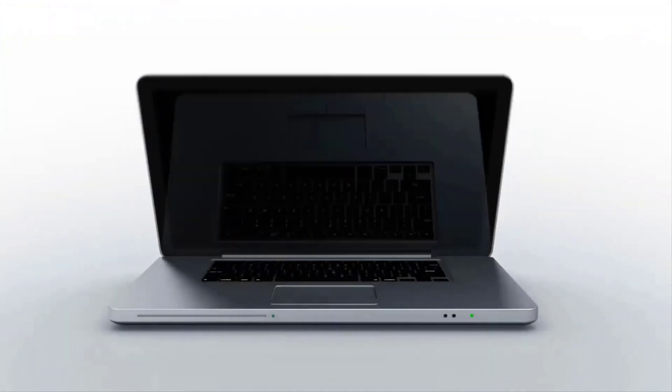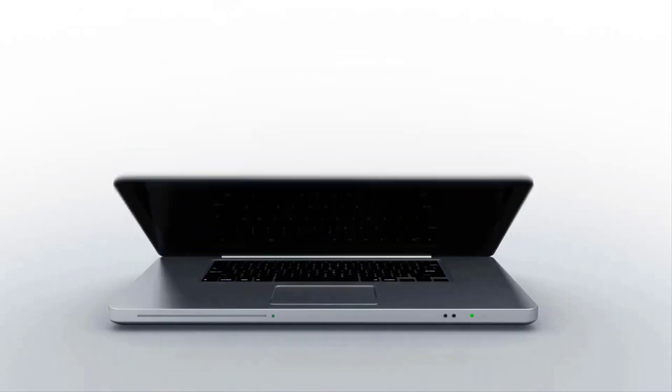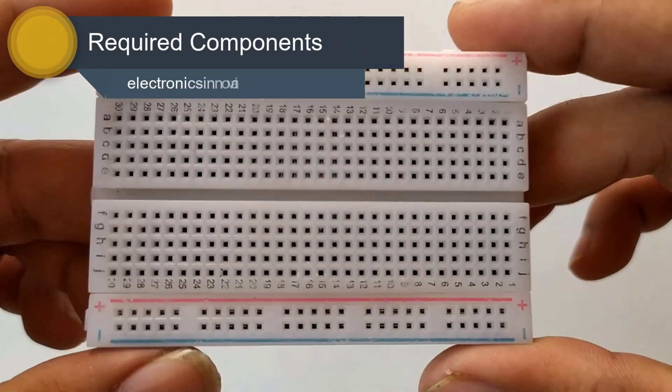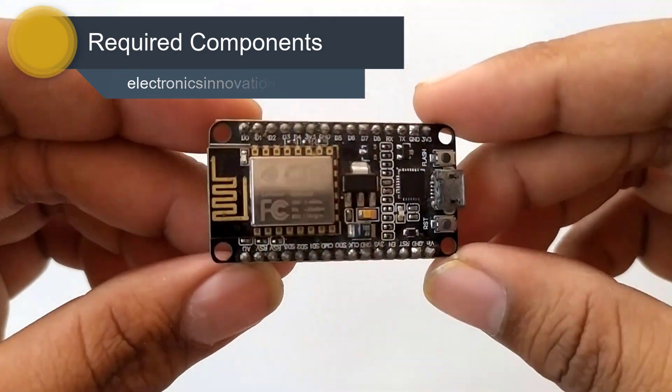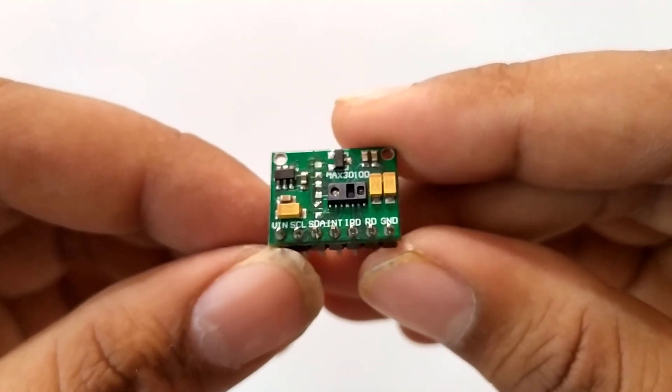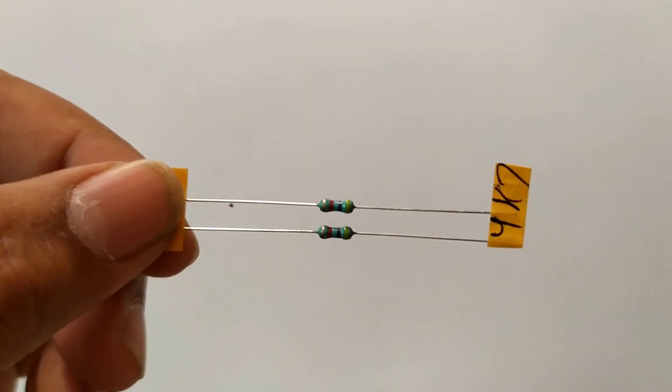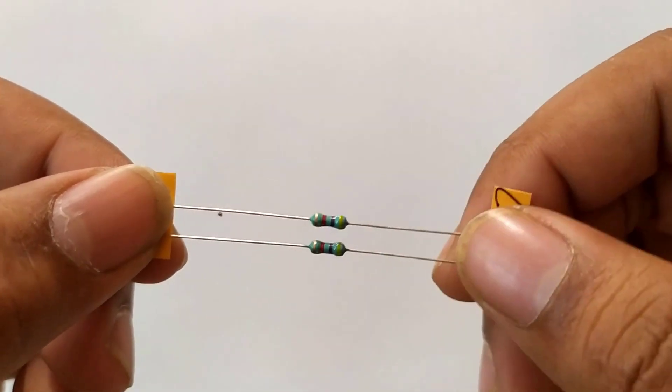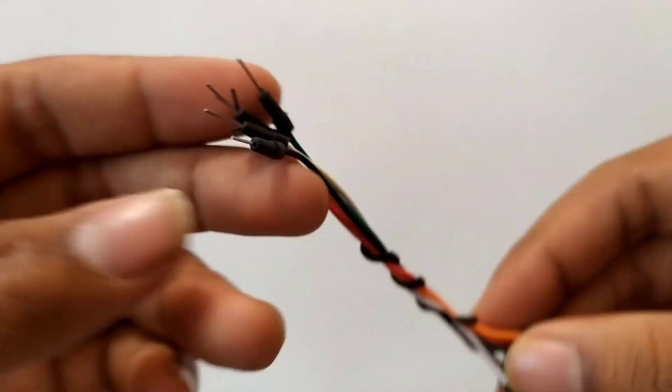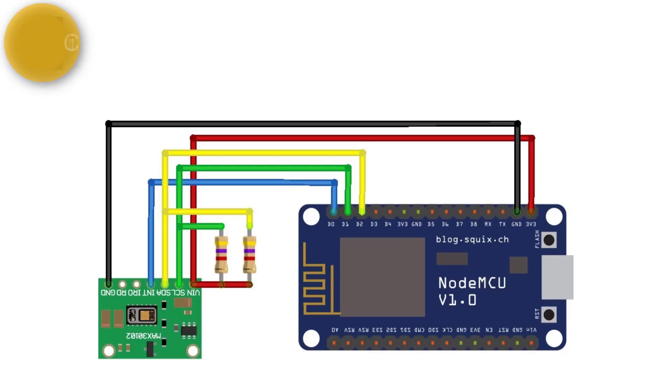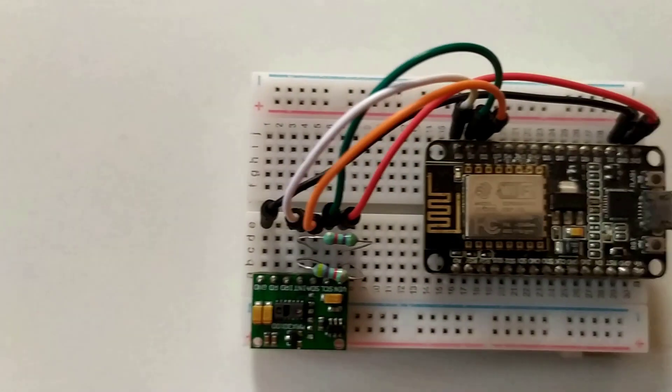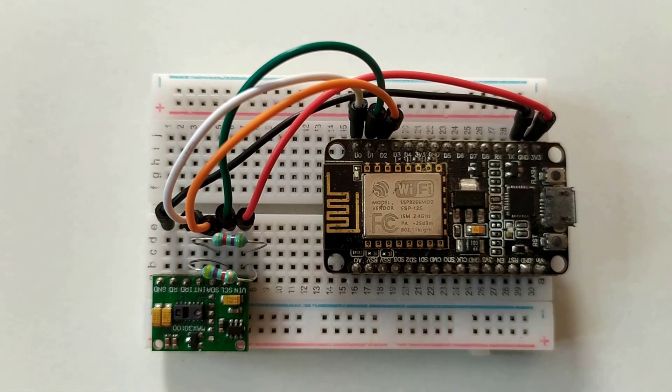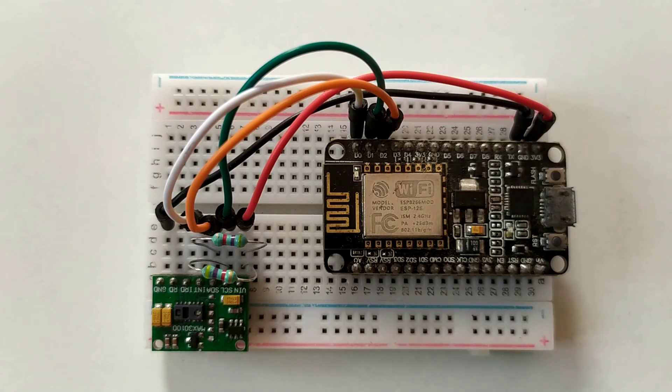Required components: breadboard, ESP8266 module, MAX30100 pulse oximeter sensor, 4.7 kOhm resistors, and connecting wires. Here is the circuit diagram for IoT-based smart patient blood oxygen meter with ESP8266 module. Connect the MAX30100 sensor module with ESP8266 and add two pull-up resistors to the SDA and SCL data lines of the sensor as shown in the circuit diagram.